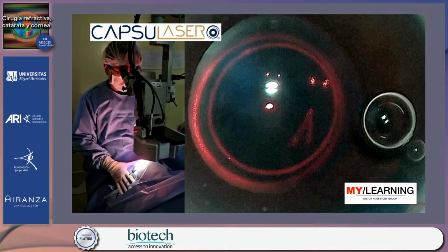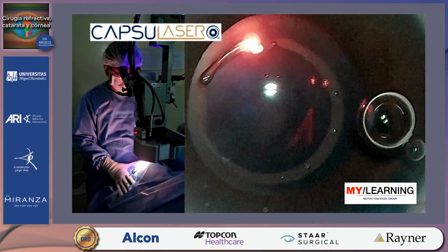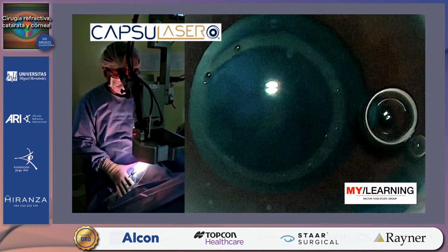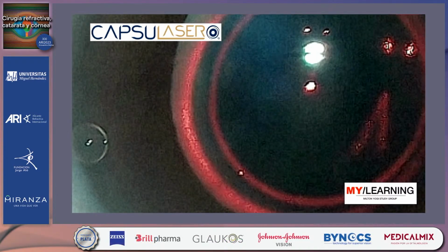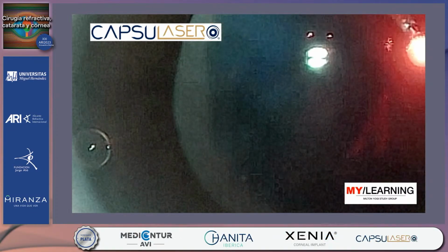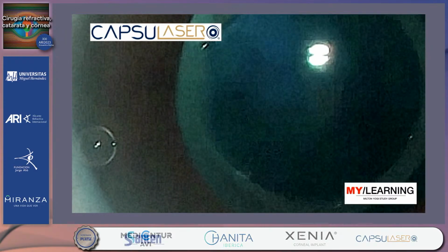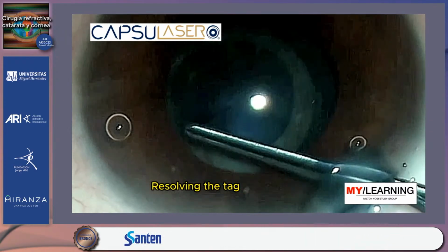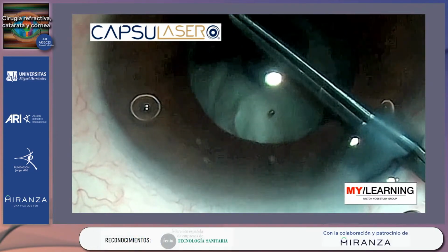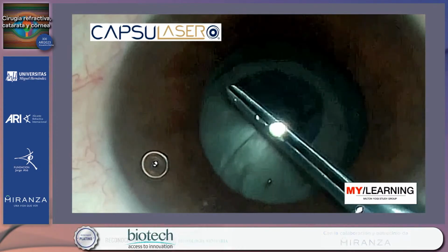And this video shows off in slow motion the untreated area in which the stain was not very good at the left. And in this slow motion video, we can see the laser not performing the action in the left area, but it was very easily solved, and it presented no challenge at all.